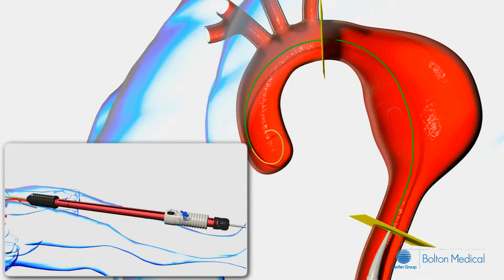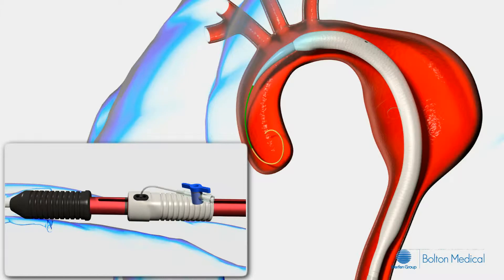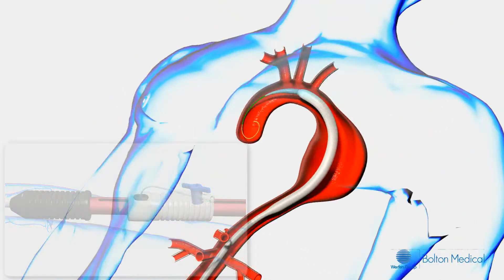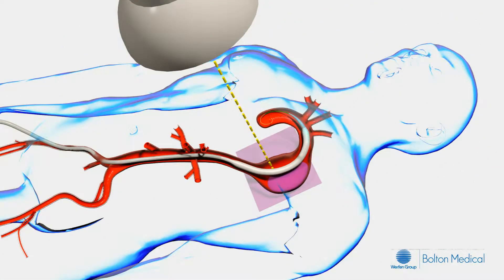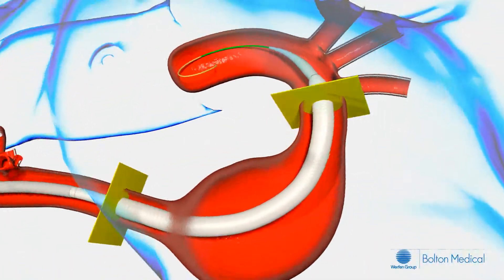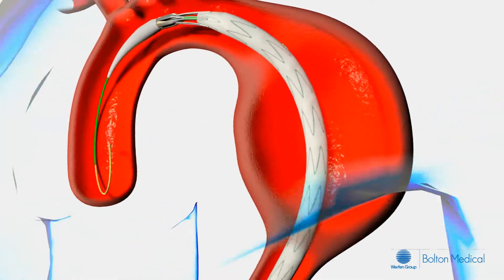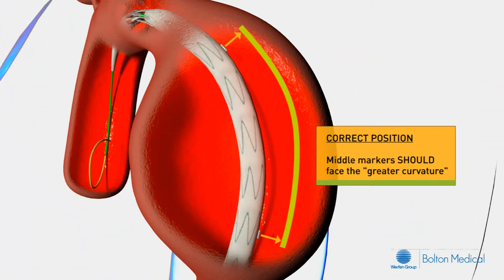While holding the black stationary grip, push the gray deployment grip forward, completely advancing the inner sheath. Verify that the gray deployment grip has reached or passed the black line on the handle. As you advance the stent graft, you will see the middle marker bands rotating and aligning to the desired position along the greater curvature. Confirm proper positioning in preparation for deployment.